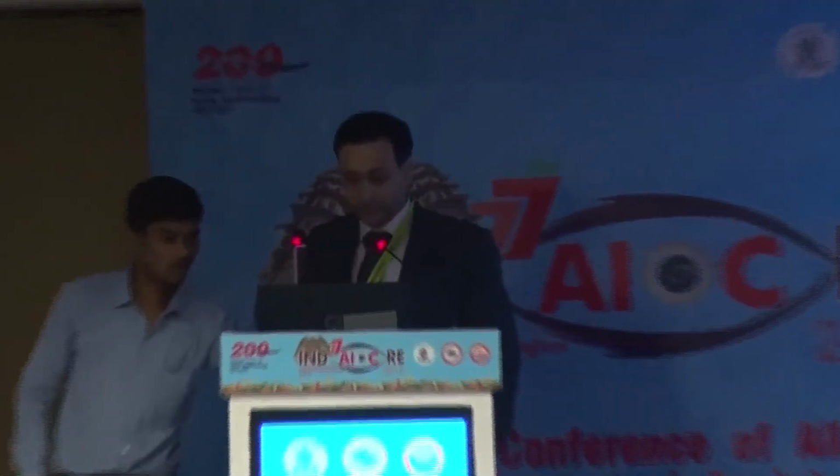Dr. Anand, would you start treatment without an ICG nowadays, just based on an OCTA? I'm still at this point in time validating that technology. So as of now, it's not possible to say that OCT angiography is the gold standard. The gold standard still is ICG angiography. I'm presuming you're talking about PCV. So you have to demonstrate.